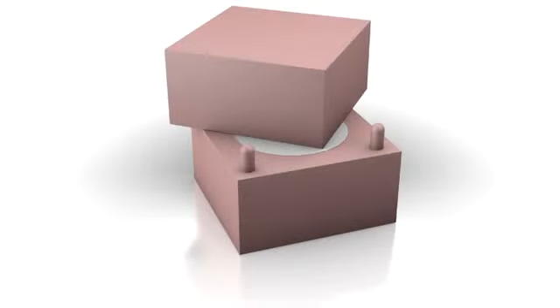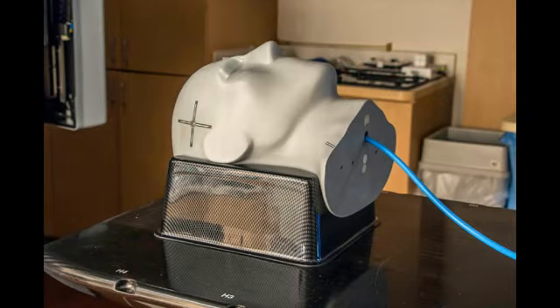Here's another type of example insert, plastic, and then embedded in that a little circular or spherical gray target that you can visualize. And then you can insert film between these two slices. And here's what this type of thing might look like on imaging. You could also insert ionization chambers into these phantoms and do measurements.